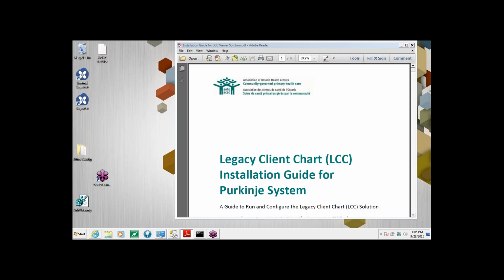PNG that are currently on Nightingale and have migrated from PNG. For the other sites, like the AX that are going to move from Healthscreen to this system, or the Francophone sites that are planned to migrate in Nightingale at a later time, this presentation and webinar will be represented at that time, as some changes may occur during then.